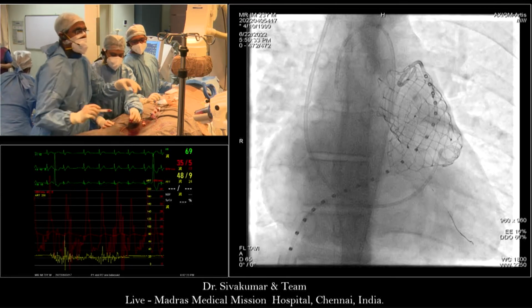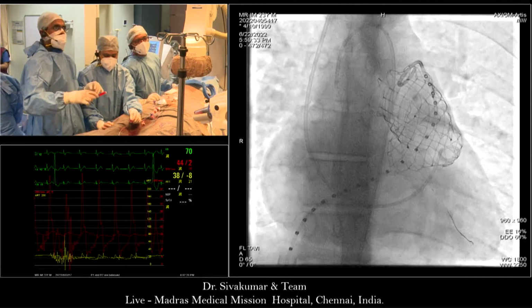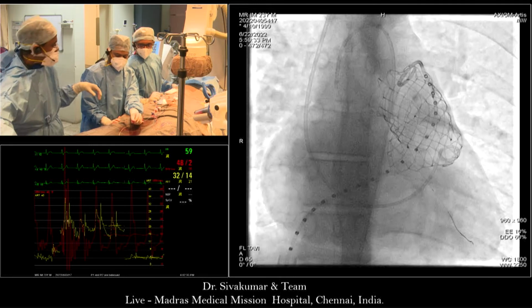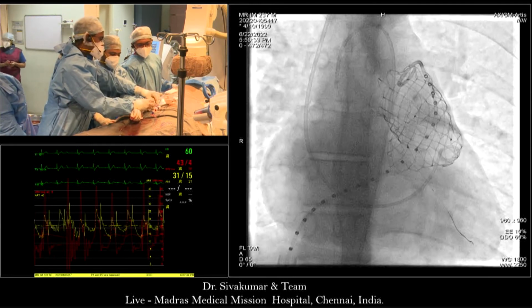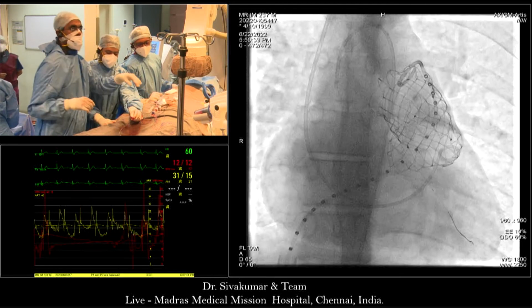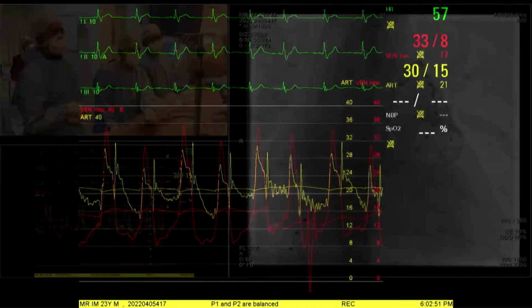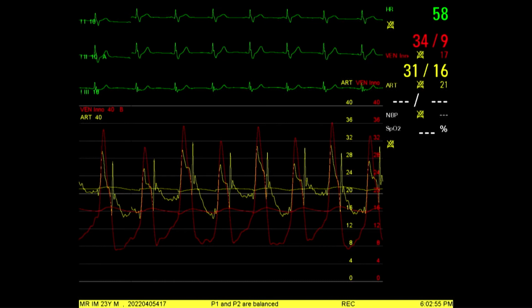So retrievability, if you put it on the same scale or something similar, is that up to about half the valve exposed, you can recapture it. You can't recapture it with the delivery system covering sheath once you expose the distal flare and the hemodynamics become big. Then you can't. So that's why change the color to white, the RV to white color.